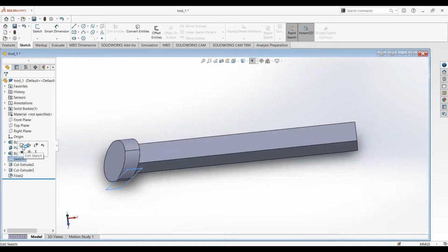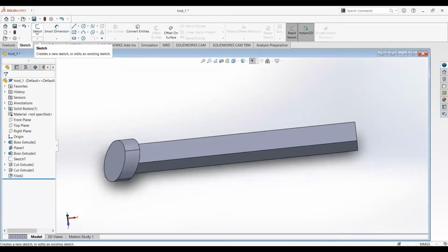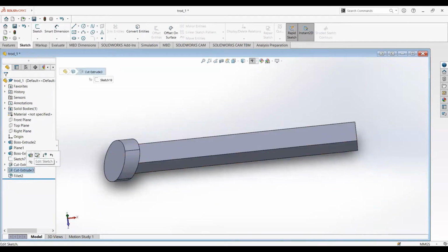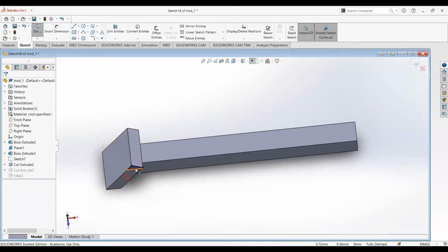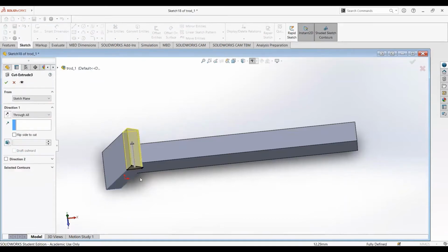After that, we sketched this part because we are going to cut extrude the side. Like it kind of looks like a triangle. Right here, we're going to extrude that the next step. So if you look at the sketch right here. So this is what we did. We connected with all the lines right here. And then we extruded this part.